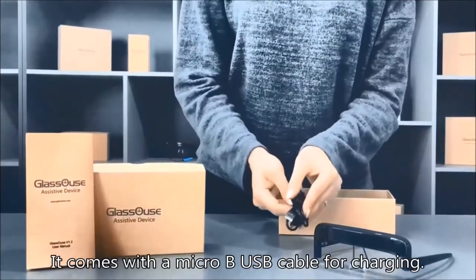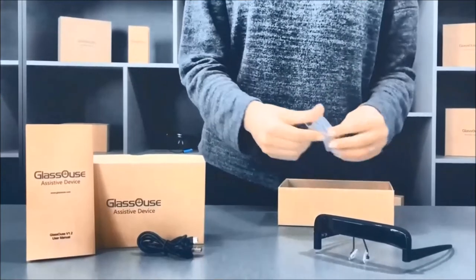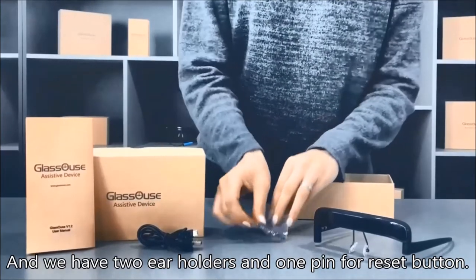It comes with a micro USB cable for charging. We also have two ear holders and one pin for the reset button.